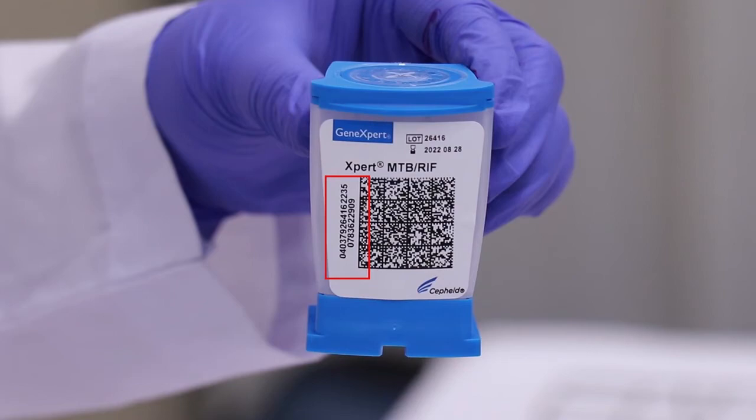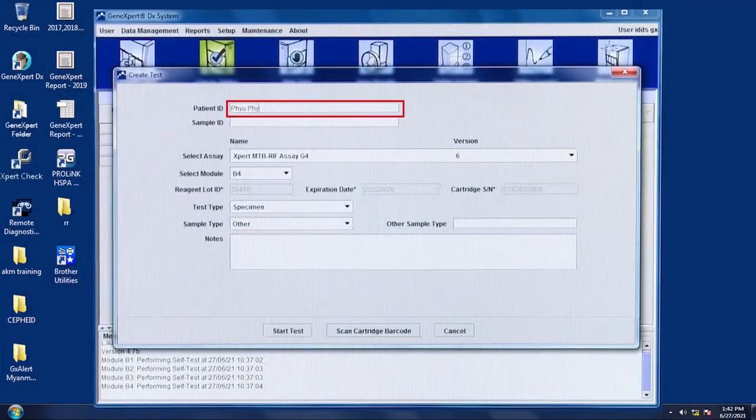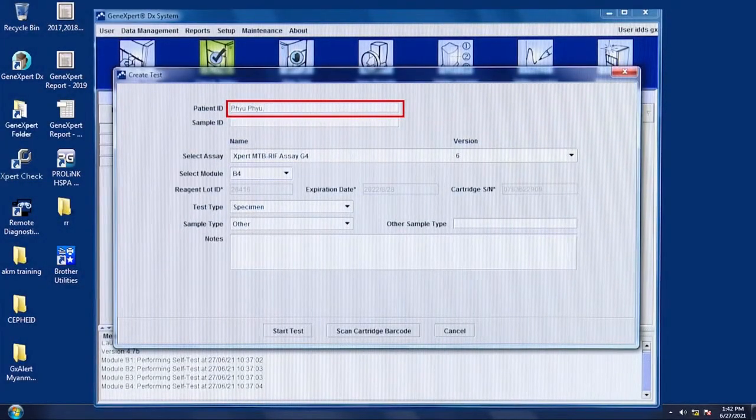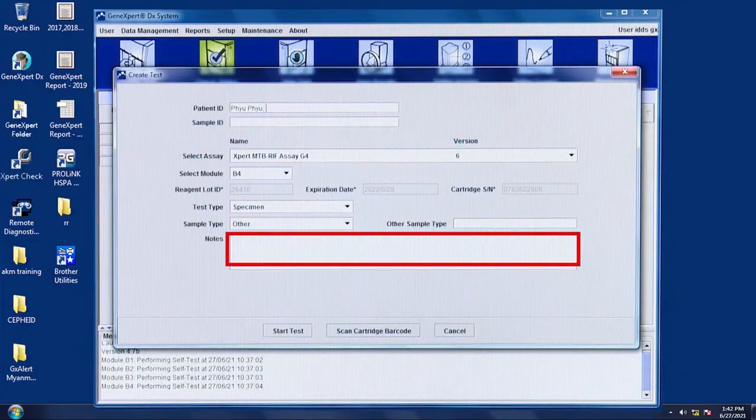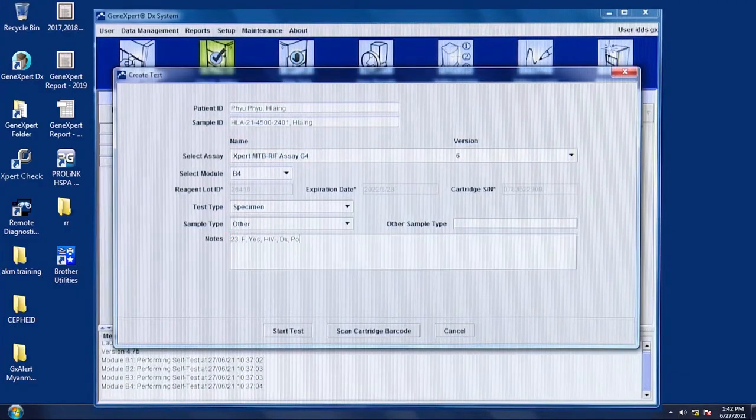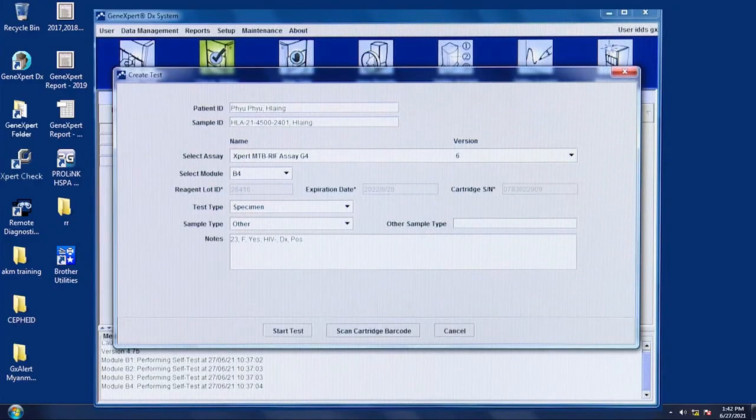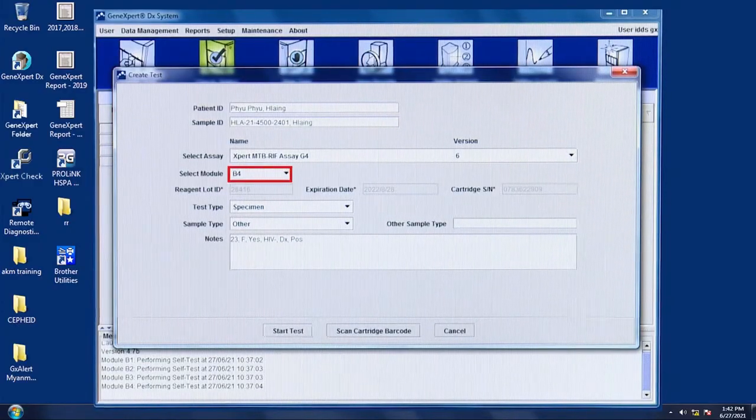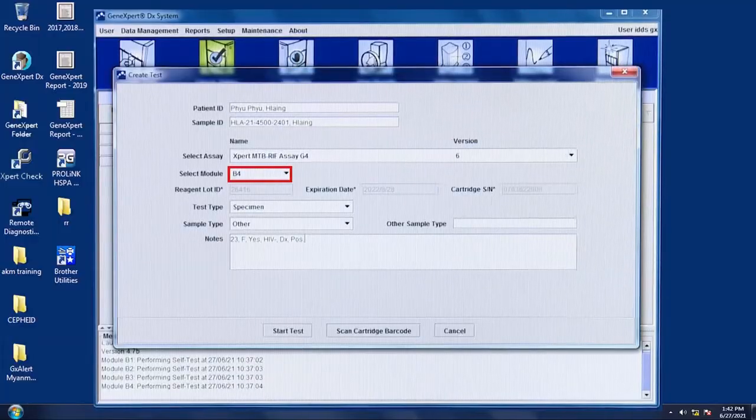Then, Create Test window with data entry form appears. The software automatically fills the boxes for the following fields: Select Assay, Reagent Lot ID, Cartridge SN, and Expiration Date using the barcode information.